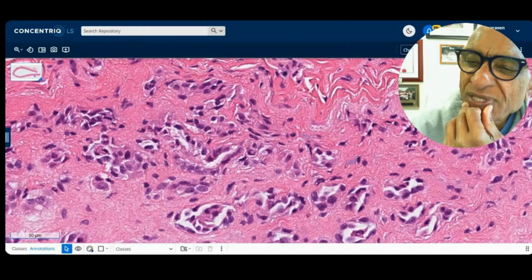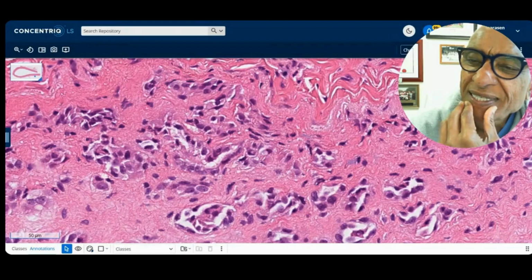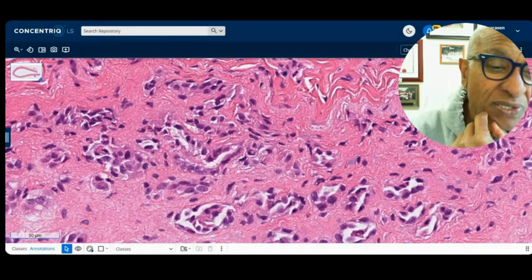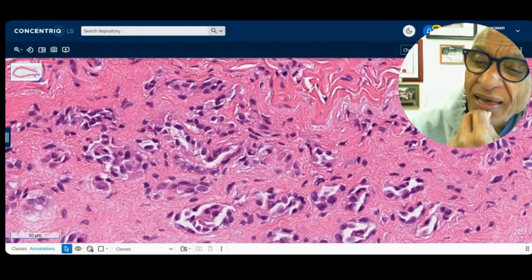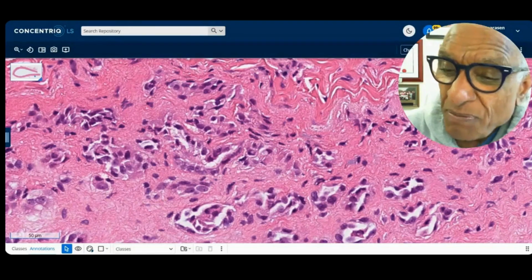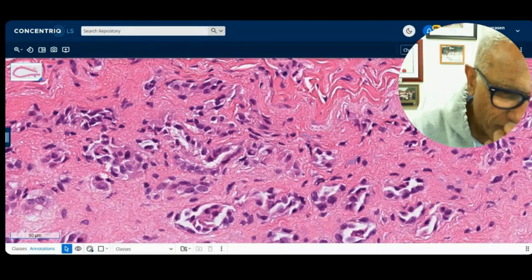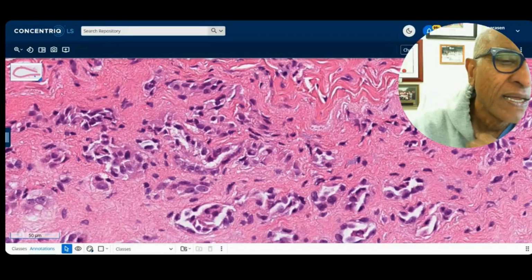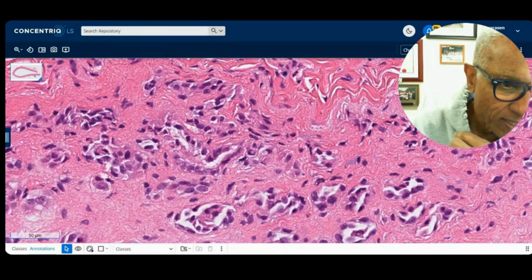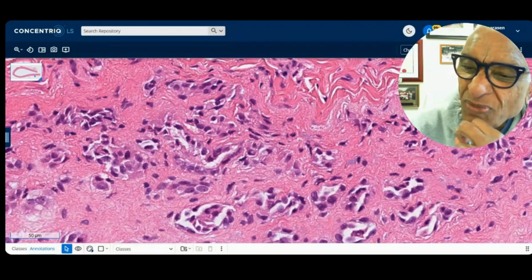You want a CD34, CD31, yeah. For discussion purposes, let's say that that's negative. Gerson suggests a cytokeratin stain. That's very useful because these gland-like structures are diffusely cytokeratin positive. And Omar is suggesting, as well as Priti, mesothelial. So mesothelial markers are positive in these gland-like structures. I cannot remember which ones were positive, but certainly calretinin was positive. And I don't remember whether D2-40 and WT1 and CK5/6 were positive, but there were at least two markers positive. So I was very happy that these were mesothelial cells. Gland-like structures may be metastatic adenocarcinoma.